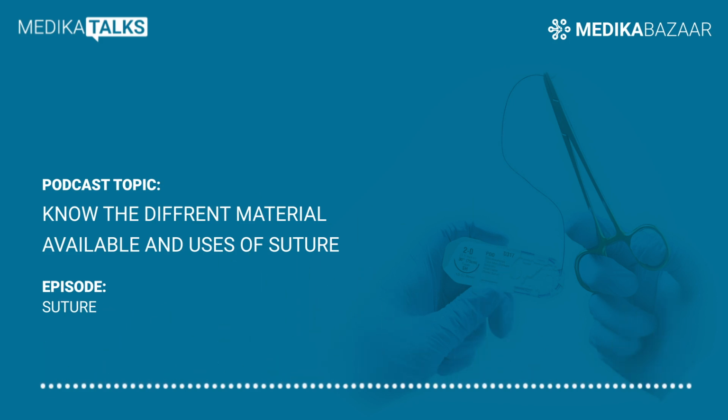Are there any variations of sizes in the suture? The diameter of the suture will affect its handling properties and tensile strength. The larger the size number ascribed to the suture, the smaller the diameter is. For example, a 7-0 suture is smaller than a 4-0 suture. When choosing suture size, the smallest size possible should be chosen, taking into account the natural strength of the tissue.